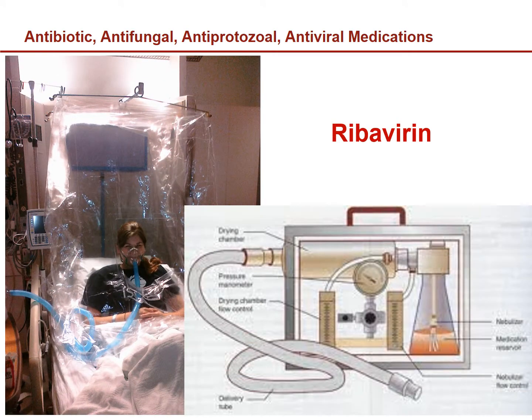Ribavirin is an antiviral agent used in the treatment of patients with respiratory syncytial virus. Ribavirin requires special handling and cleanup procedures along with specialized equipment, the SPAG and a dedicated tent. Ribavirin is now a non-formulary medication that requires pharmacy approval of any order. As it is seldom given, it is considered a high-risk, low-occurrence procedure and will have a separate, dedicated educational module and competency. Please contact a resource therapist or supervisor should you receive an order for ribavirin administration.